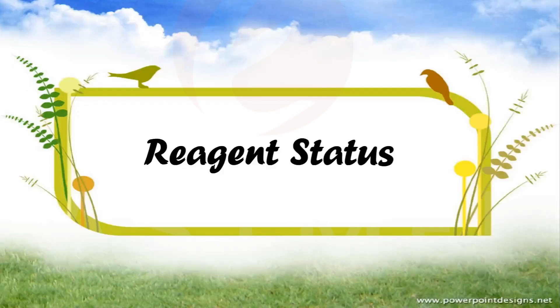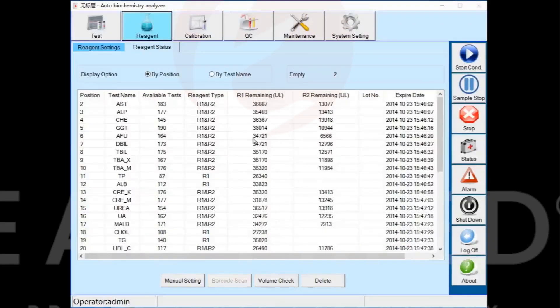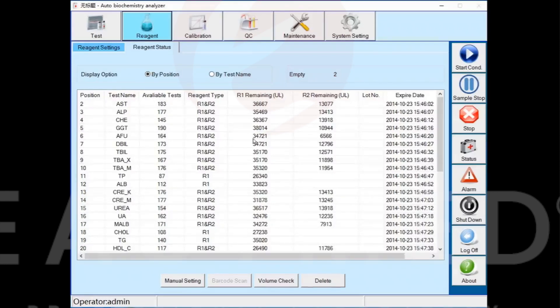Fifth part: reagent status. In the reagent status interface, you can see the reagent's position and status. You can choose to sort by position or by name.